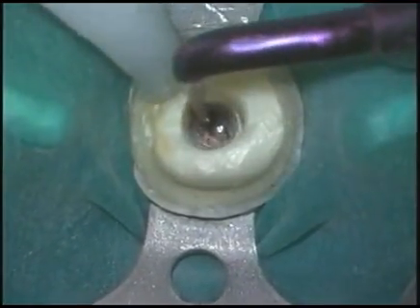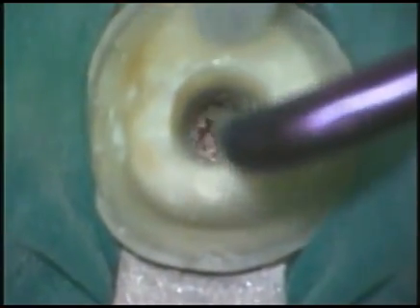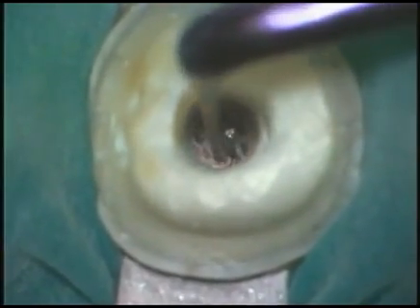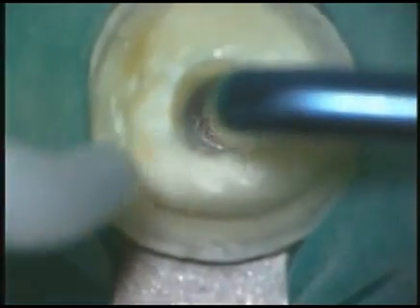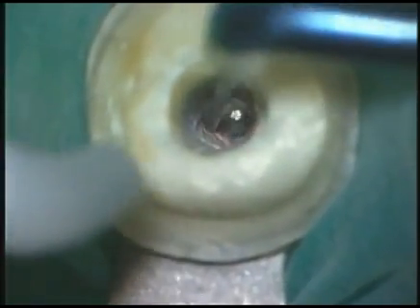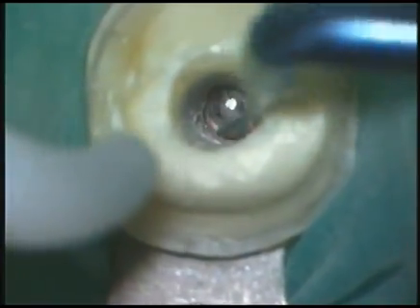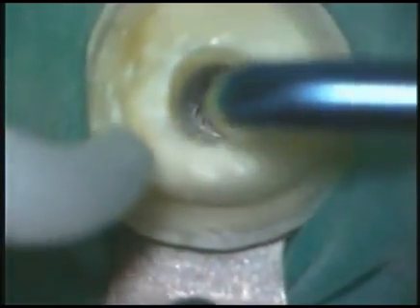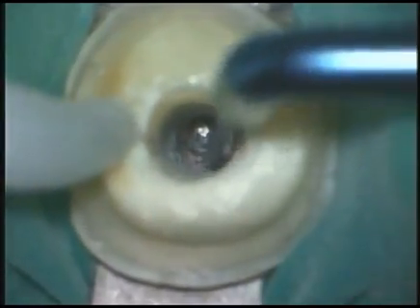This is a nickel titanium file, and you can begin to see it move, and at higher mag, you can see the cutting action is progressively freeing up the head of the instrument. Ultrasonics is always performed cutting dry. We don't use water because water, in the presence of debris, would form a sludge or a slurry which would block our vision. The stropko very efficiently blows this debris out, which keeps our vision on the obstruction at all times. This keeps us centered in the root and prevents us from performing iatrogenic events.